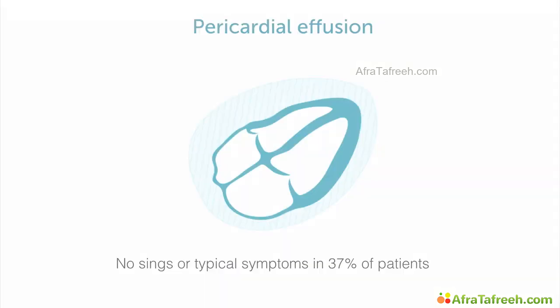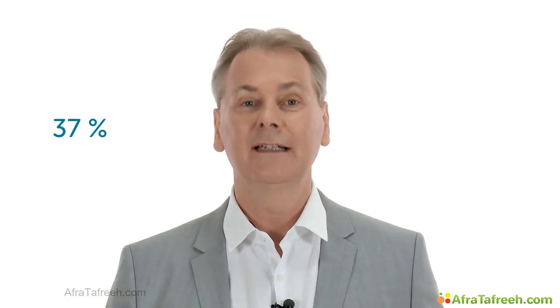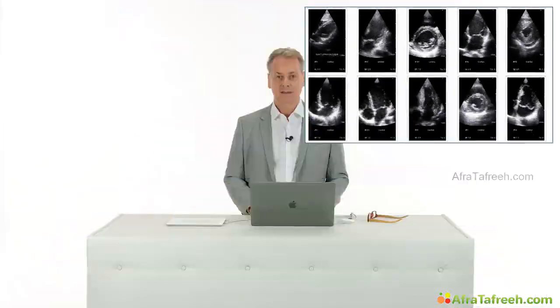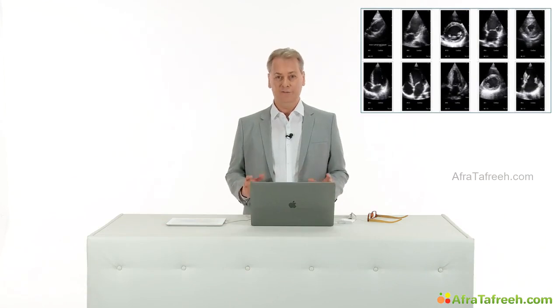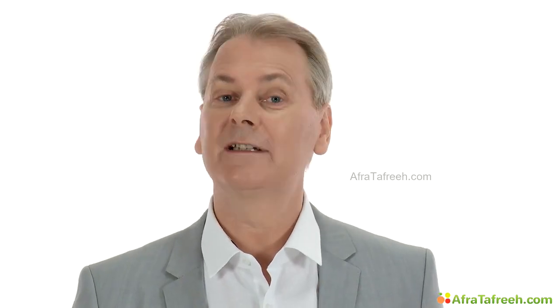And how good is the physical exam if you want to detect a pericardial effusion? Even worse. Don't forget that 37% of patients actually don't have any signs or symptoms that are indicative of a pericardial effusion. Here, ultrasound will be extremely important. So what is the bottom line? Ultrasound is slowly moving to the forefront of diagnostics, and it is complementary to the physical exam. But let's hear some of the statements from key experts who've been using ultrasound for many years.